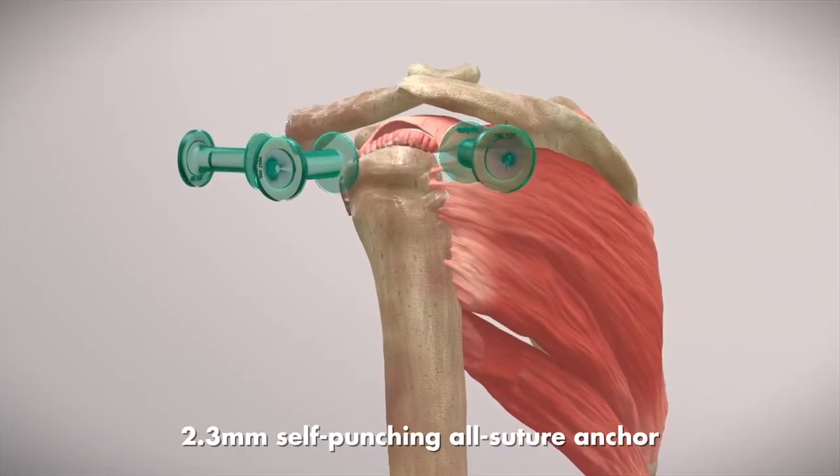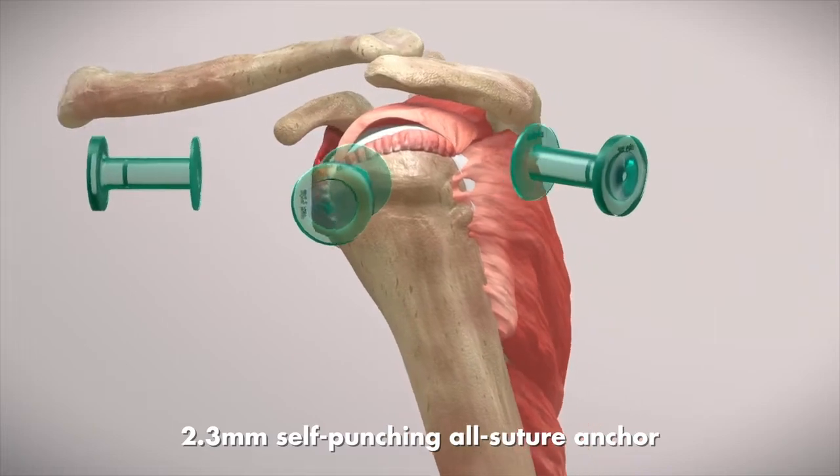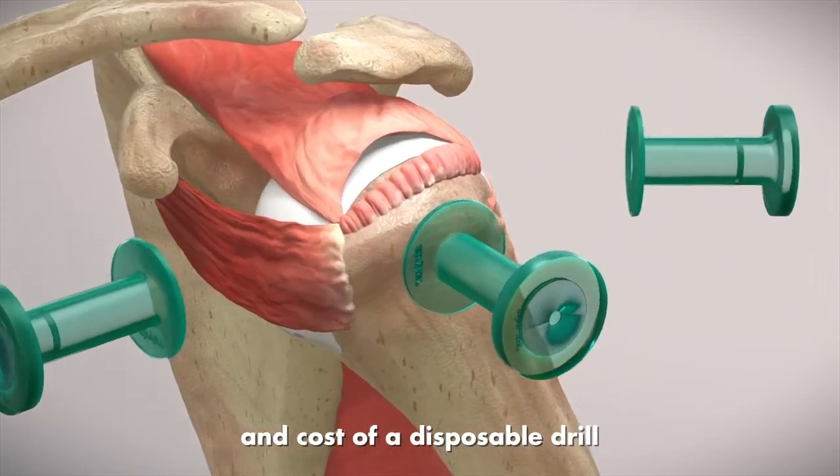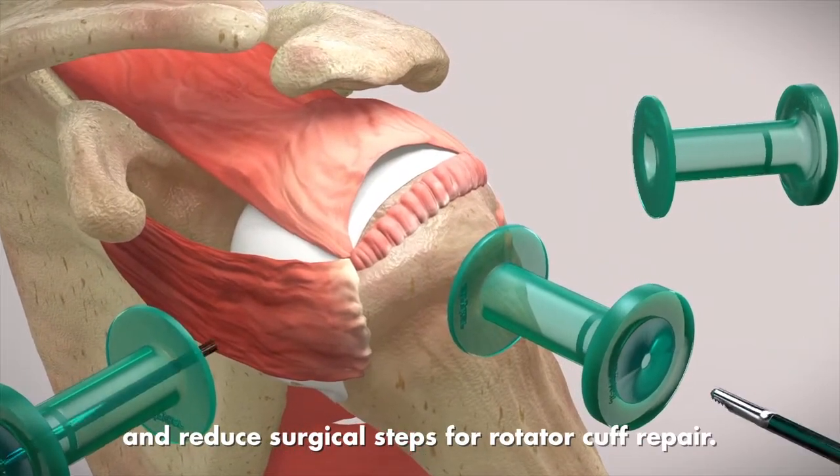Stryker's ICONICS SPEED is a 2.3mm self-punching all-suture anchor designed to eliminate the need and cost of a disposable drill and reduce surgical steps for rotator cuff repair.